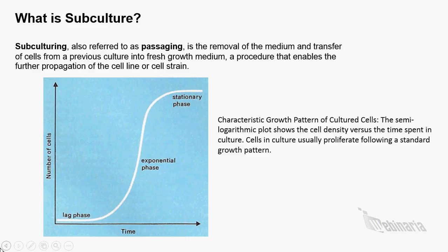So what is subculture? Well, subculture can be defined as passaging, or removal of the medium and transfer of cells from a previous culture into a fresh growth medium.